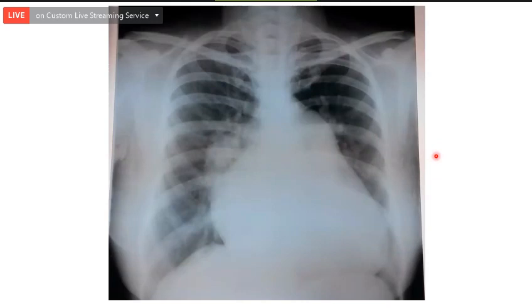Okay, comments. Anybody can try. See, all of you must try. Is Hagen not there? Yes, sir. Why can't you try? Yes, sir. Good evening, sir. Good evening. Chest X-ray, PA view. Okay. On left side, if you see the pulmonary bay area is.